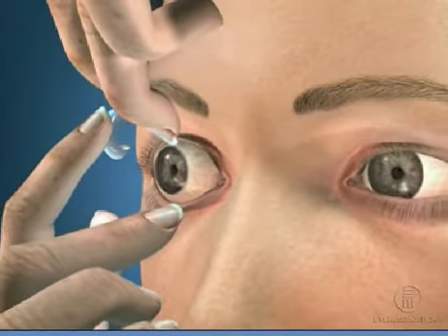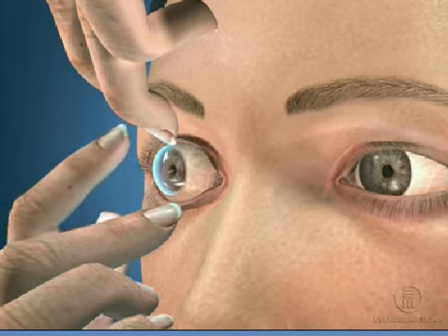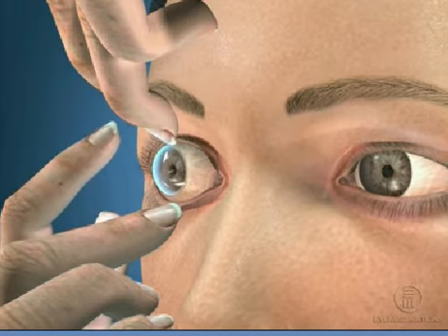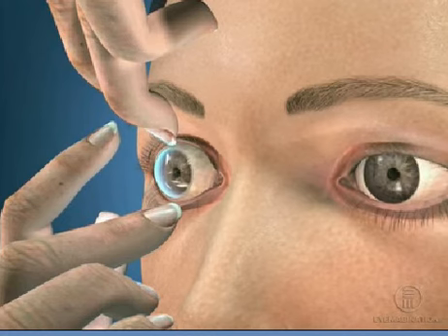Step 3 is to look forward and place the lens gently on the front part of your eye. Step 4 is to look down and then to the right and left to center the lens on your eye.